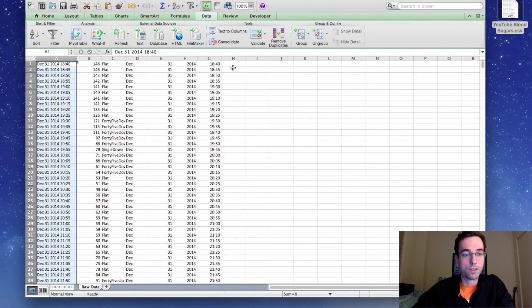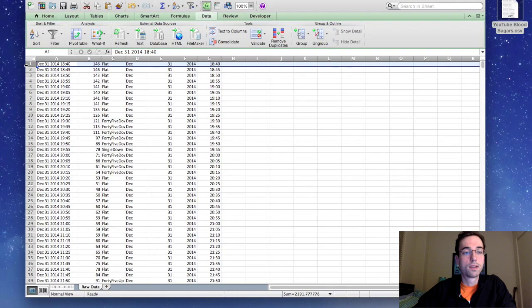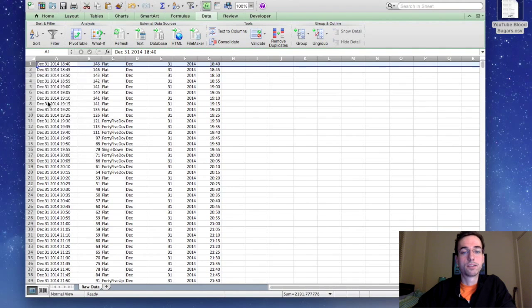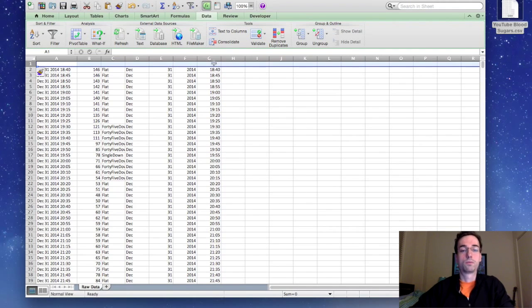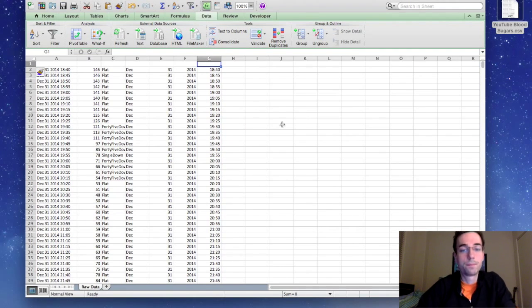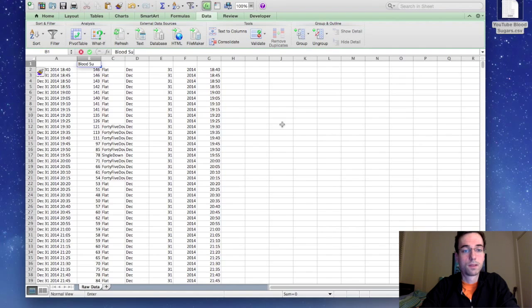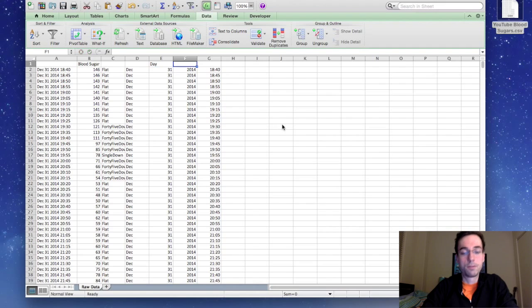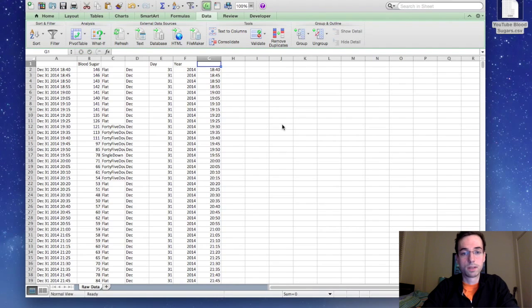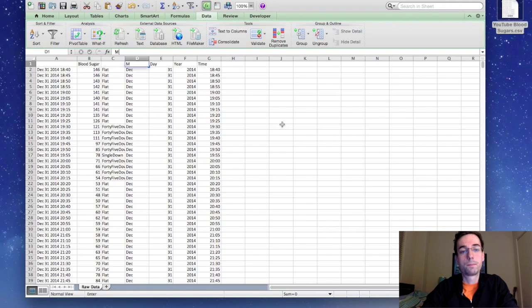Okay, now the next thing we're going to do is we're going to add a row. So you're going to want to highlight row one. You're going to go to insert. You're going to right click and then click insert. And the reason for that is we need to come up with headings so we don't forget what those are. So column B, we're going to say blood sugar. In column E, we're going to say day. F, we're going to say year. G, we're going to say time. And D, we're going to say month.